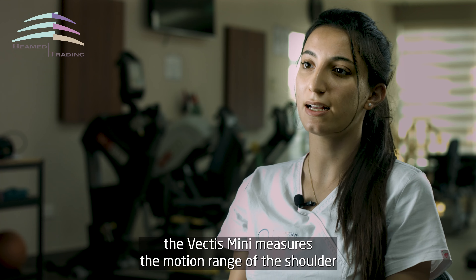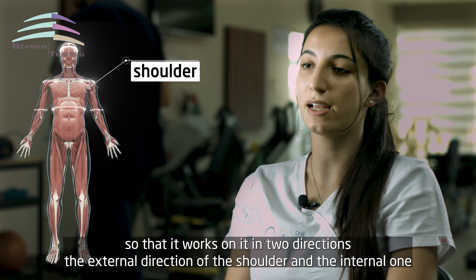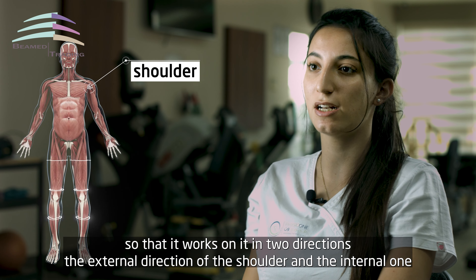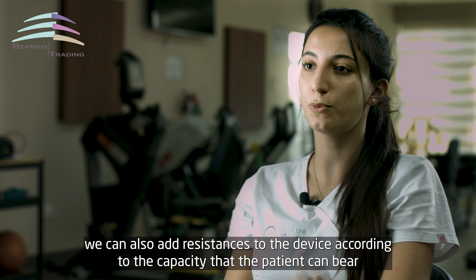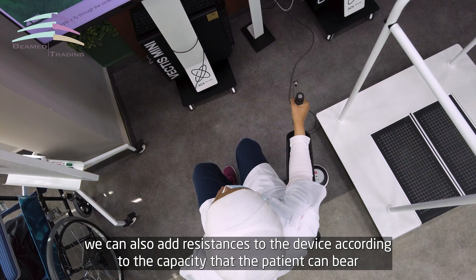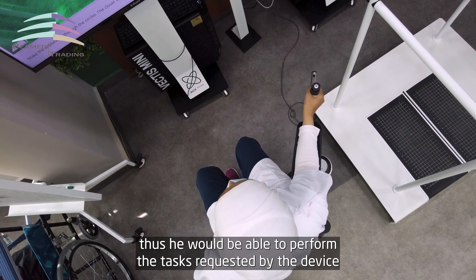الجهاز الفيكتس ميني بيقيس عنا المدى الحركي للكتف، بحيث إنه بيشتغل عليه باتجاهين: الاتجاه الخارجي للكتف والاتجاه الداخلي. وبنفس الشي عن طريق مقاومات ممكن نضيفها على الجهاز حسب القدرة اللي بيقدر يستحملها المريض، وبالتالي لحتى ينفذ المهام اللي بطلبها منه الجهاز.